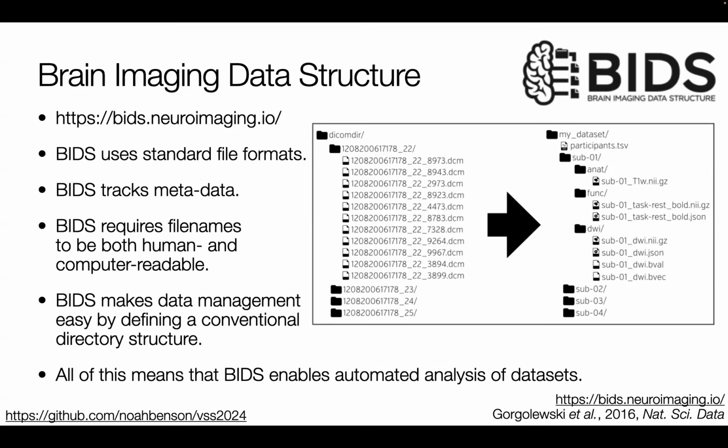It uses very standard file formats. NIfTI files are the basic unit of the BIDS structure, and also JSON, tab separated value files, things like that. It just makes data management much easier because it defines the directory structure you need to be using.